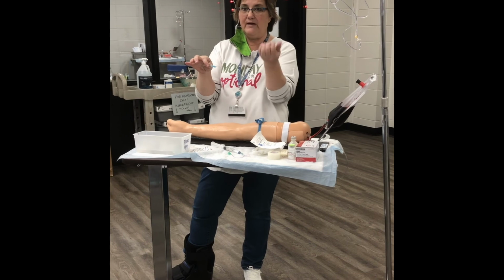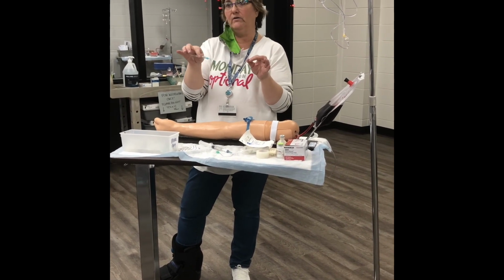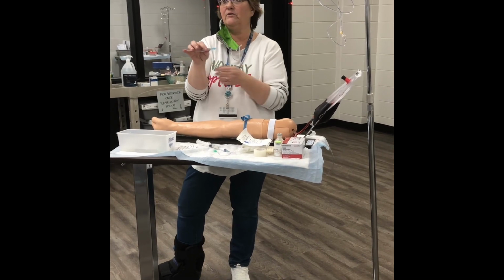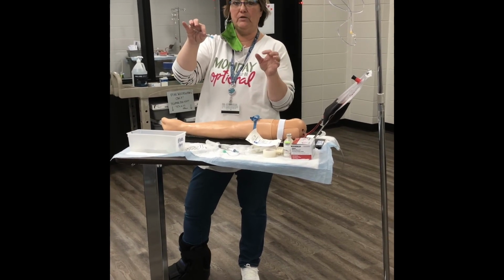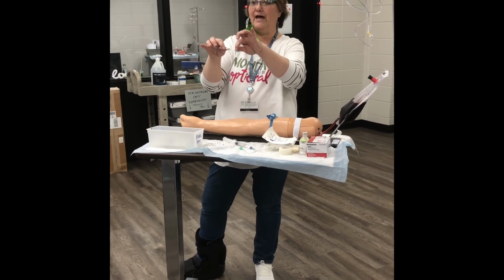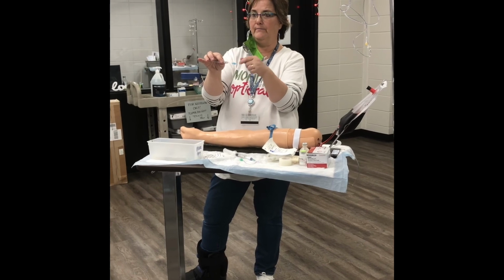You will feel the vein pop in these arms, and once you do, don't stick the needle any farther, because if you do, just like on a real person, you keep advancing the needle, you blow the back of the vein out and you have to stick them again. So you go about 20 to 25 degrees, you'll feel it pop. When you do that, don't push the needle, lower it down, take the colored part, slide it into the arm all the way to the hub, okay?